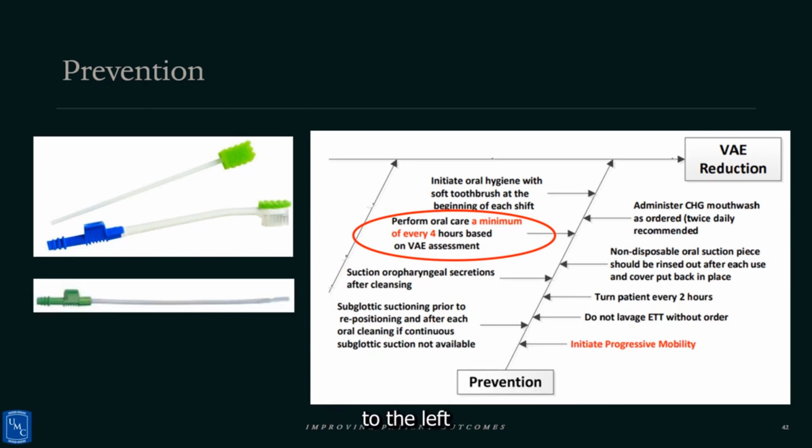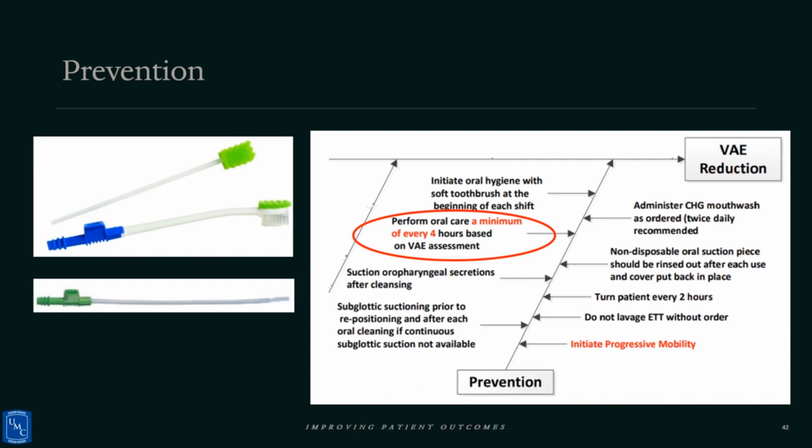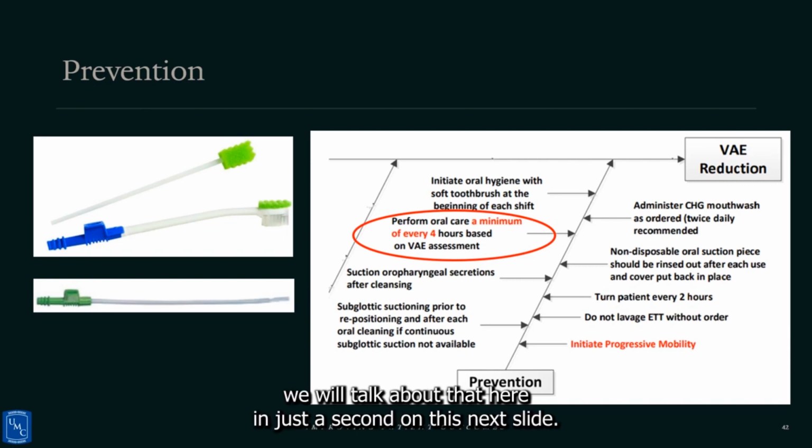To the left, you see the tool that we use to complete subglottic suctioning if your patient does not have a continuous subglottic suction device. We will talk about that here in just a second on this next slide.